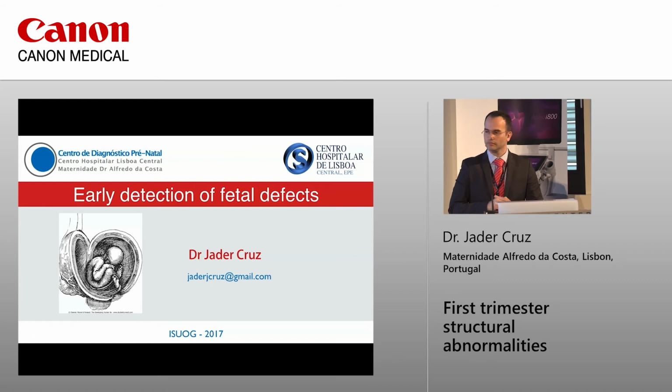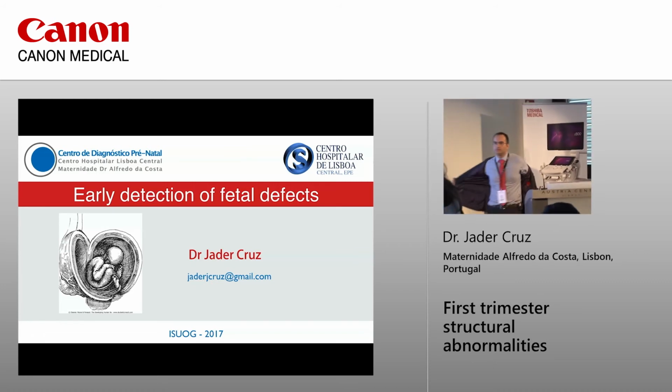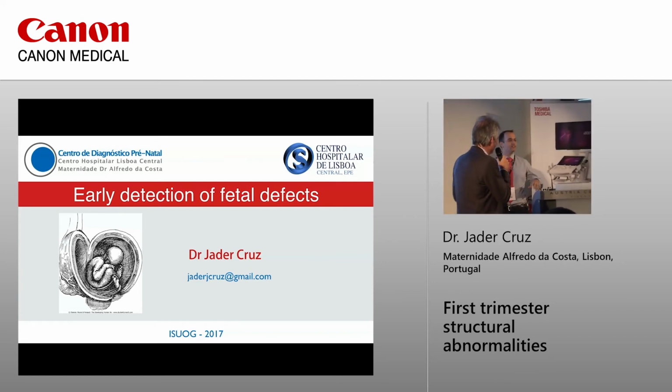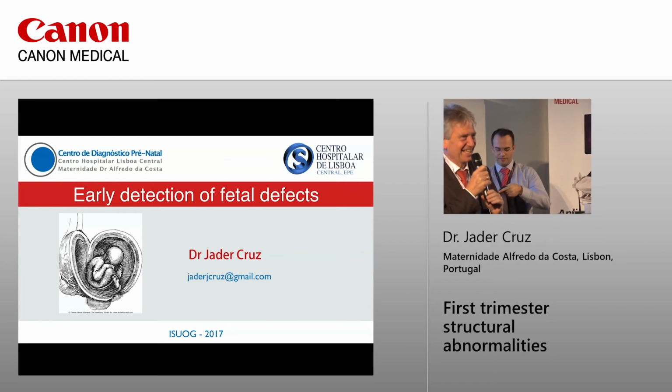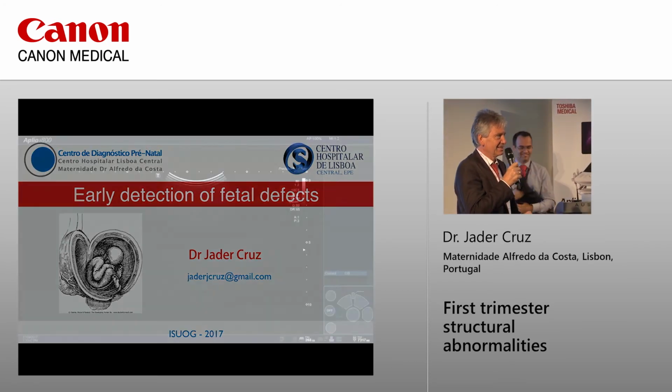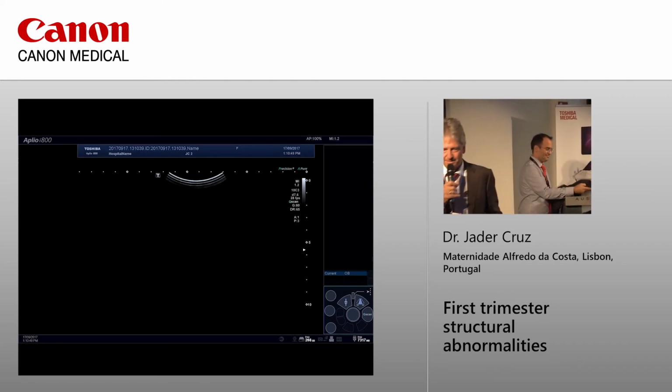Thank you very much, Jader. This was the introduction, actually, and now some questions from your audience, because now we are moving to a live scan. We're going to live scan. Hey, I'm not getting undressed. I'm just removing my... Any questions? Questions from your side? I don't see any. Okay.